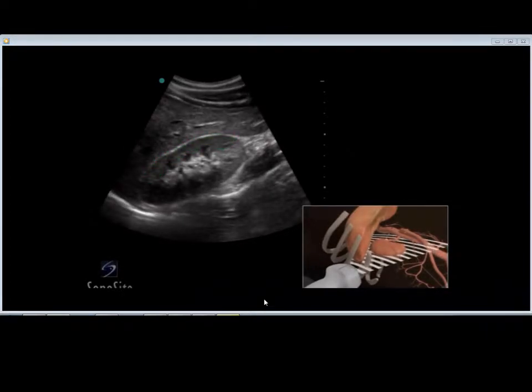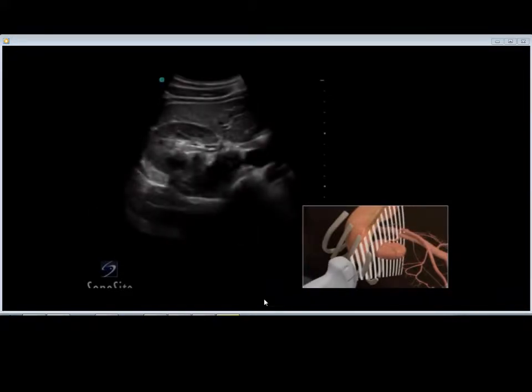As you can see, the outer cortex of the kidney is somewhat hypoechoic when compared to the liver. Moving deeper, you will see the triangular pyramids that are even more hypoechoic than the cortex, or may even appear anechoic. At the center of the kidney is the renal pelvis, which appears as bright hyperechoic space, brighter because of the increased amount of fat in that area.